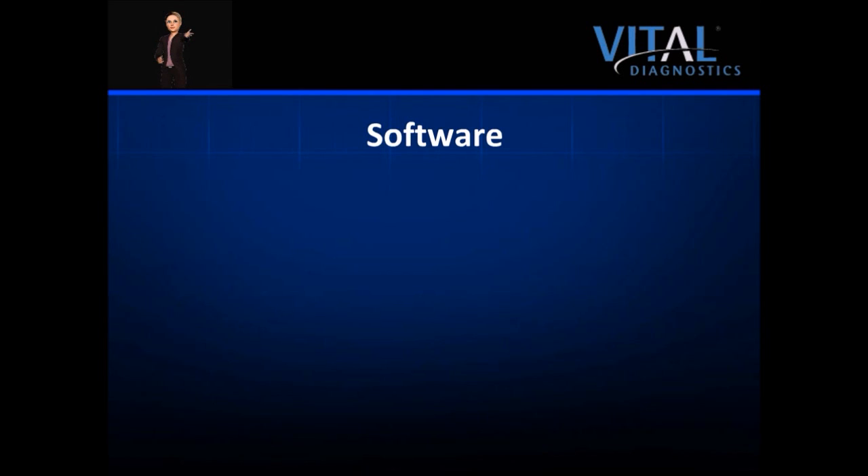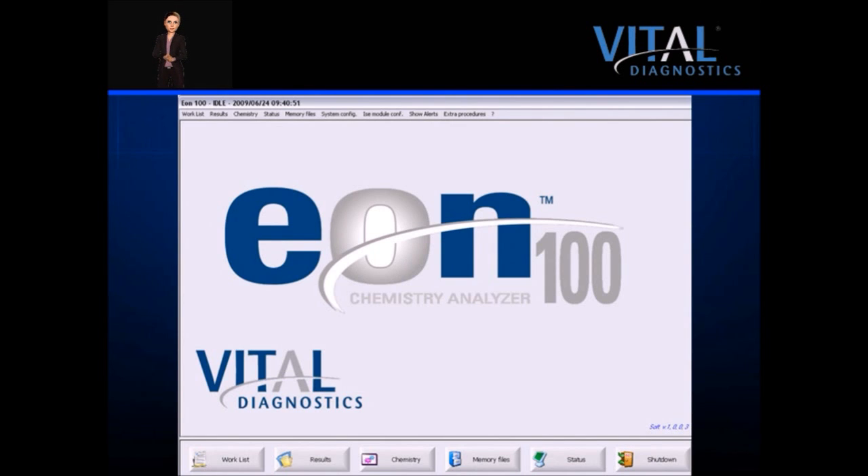We will now explore the EON100 software. The software is Windows-based, bright, and intuitive. Navigation is simple, and most screens are accessed by only one click of the mouse. The large icons at the bottom of the screen indicate the most commonly used menu options. These menu options are also displayed in the upper menu bar, along with less frequently used options. The status bar at the very top provides the operator with constant real-time updates.